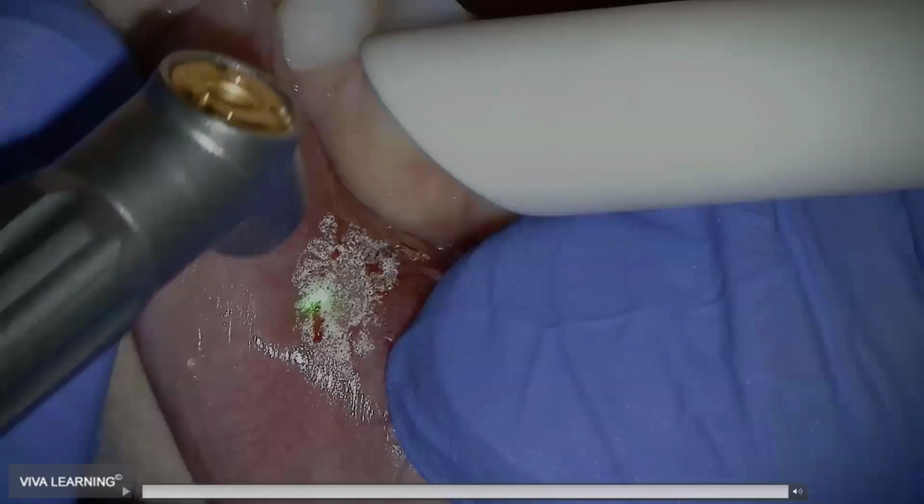By the way, I love it when it's live because we get these live questions that come in, and I wish I was here directly with you guys. Here's one question that came in, and I love the discussion of this, right? Here's the question: can a laser accidentally damage more tissue or teeth, like how it happens with a drill, where you accidentally nick or cause a pulp perforation or tissue laceration?